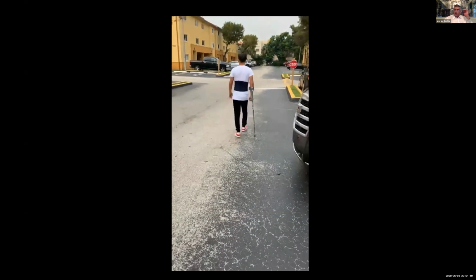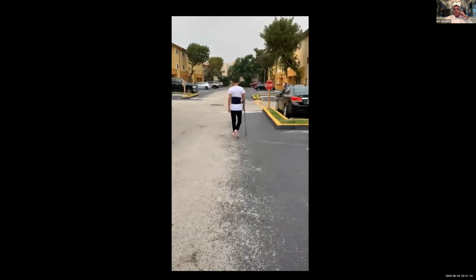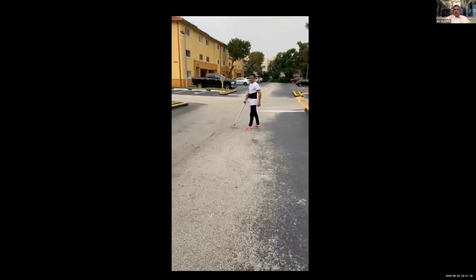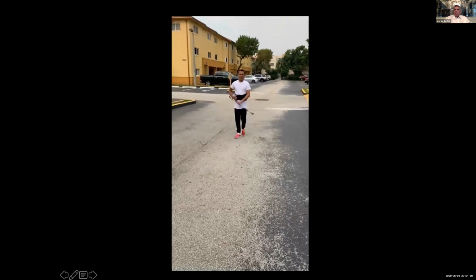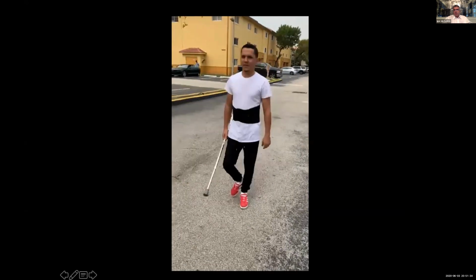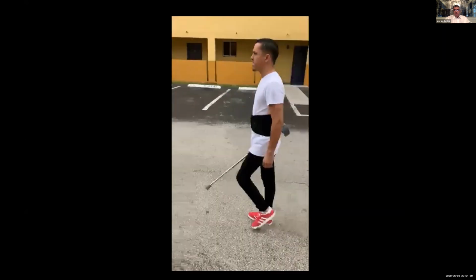Could you do the surgery without a robot? Yes. But, you know, this was a very stressful event. At 2 o'clock in the morning, somebody had already had the first surgery done, not in a good way, and we have to be precise. So that was a very, very helpful tool. So you can see he still has a lot of deficit, but he's able to walk without any assistance.